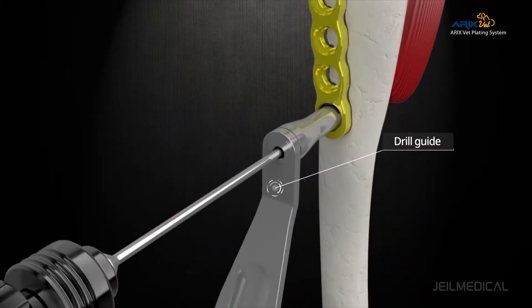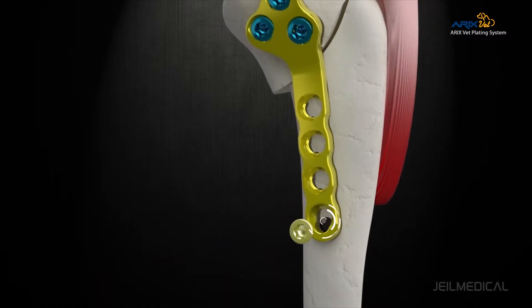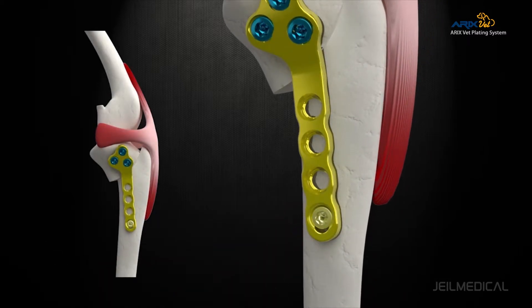The hole located at the distal end of the plate enables compression to the bone and reduction of the bone in the proximal direction.